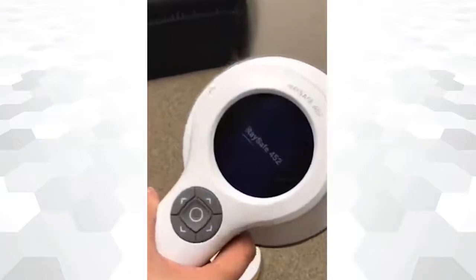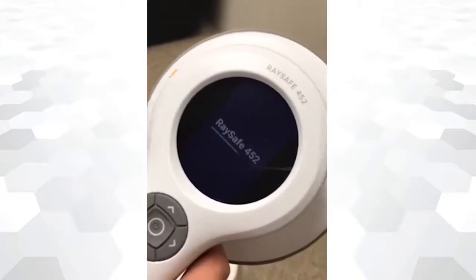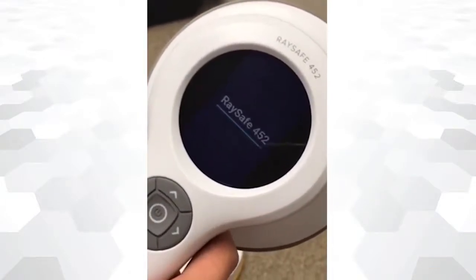To power on, press and hold the center button. The device will take around 5 seconds to initialize.